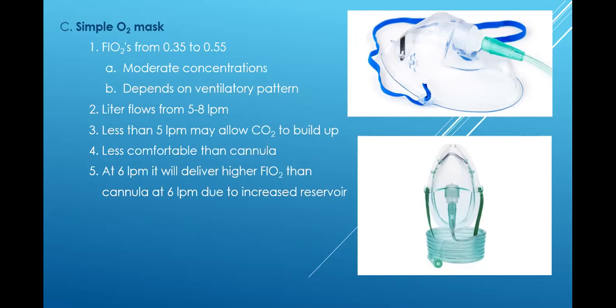Well, this is the old simple O2 mask. See this right here? Now, not only do you have the nasopharynx and oropharynx for reservoir space, but you've got the mask. This mask itself is reservoir space. Oxygen is hanging around in here till you breathe it in, okay? Any little pocket where oxygen can hide is a reservoir, all right? So this is also known as a mechanical reservoir space, right? It's not anatomic, it's mechanical. And this is what it looks like.